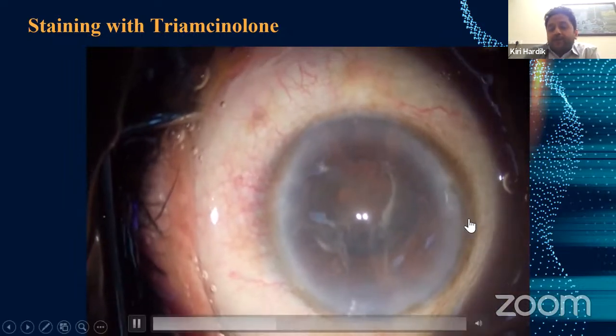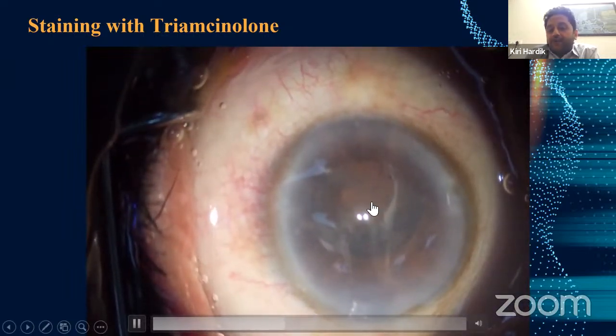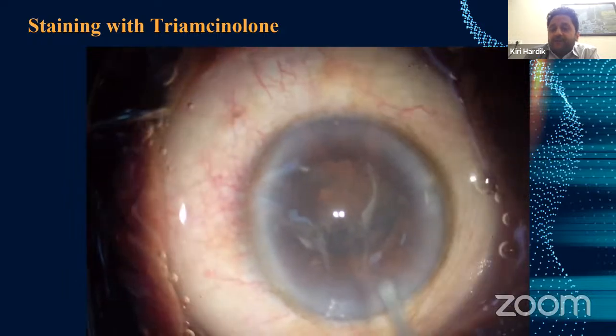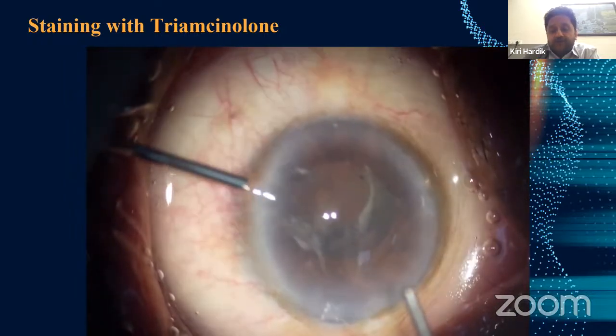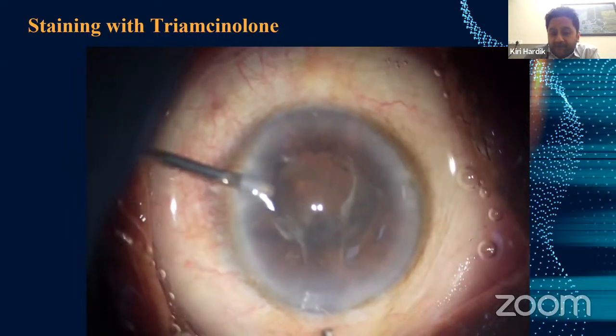And avoid putting excessive triamcinolone because it can go behind also, through the posterior capsule rupture. It can go into the posterior segment and the patient will have floaters, and in steroid responders, it can increase the intraocular pressure. So now the surgeon is planning to do a bimanual vitrectomy.